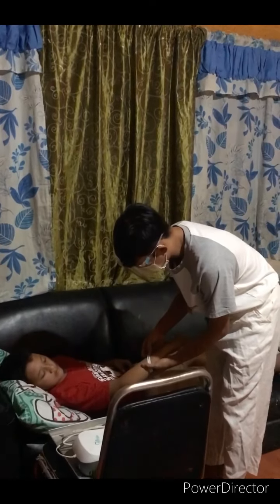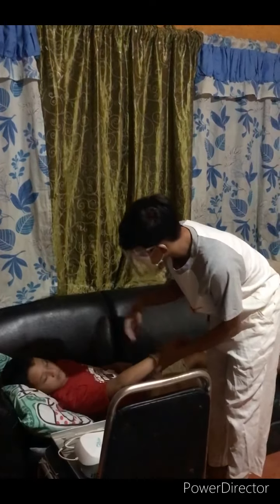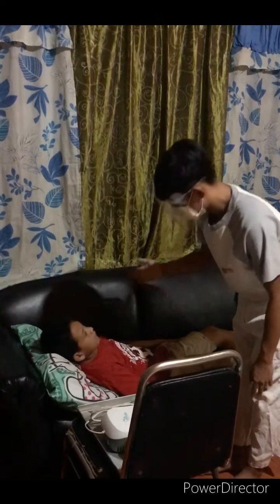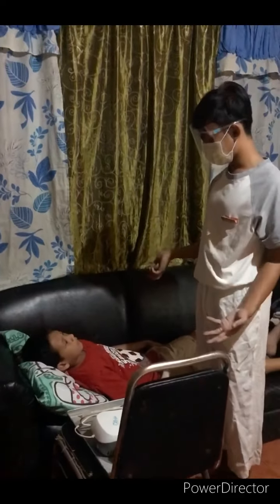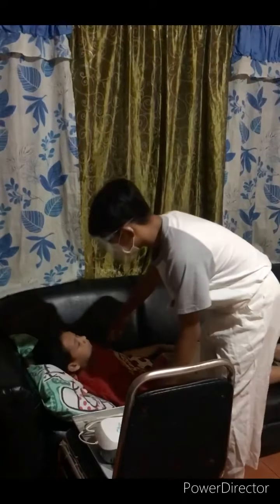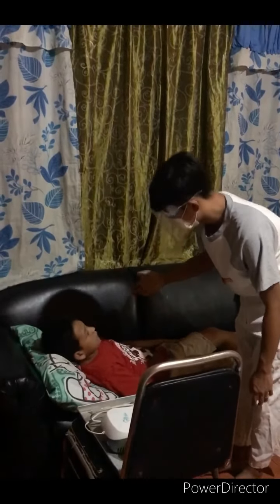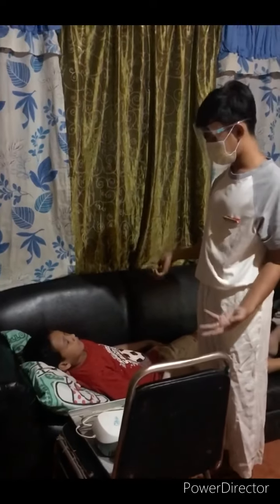Identify the patient by checking the name and identification on the patient's identification band, or ask the patient to state his or her name. Explain the procedure to the patient to gain cooperation and to allay anxiety.